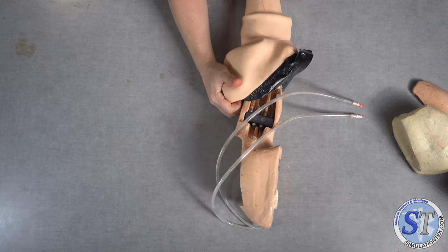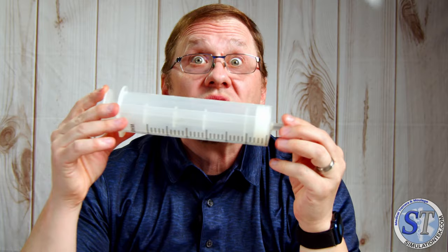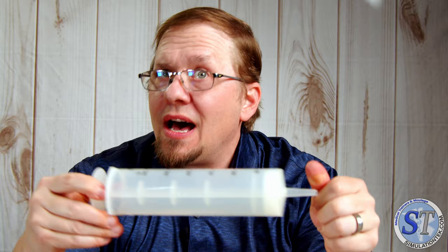And see, even pulling it against each other is kind of a pain. What we're going to do is get my pitcher like this. I like finding the biggest syringes I possibly can. It works really, really well. This one is a 300cc syringe. I've never seen one of these in the wild. I've only seen them on Amazon, so I ordered a pack of these off Amazon a while ago and I hoard them to myself.